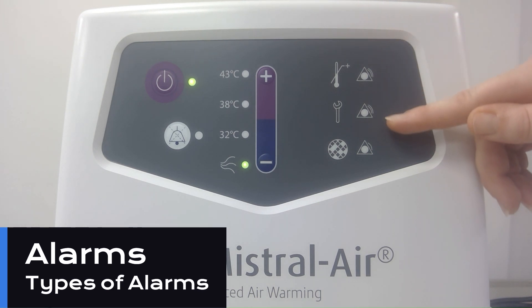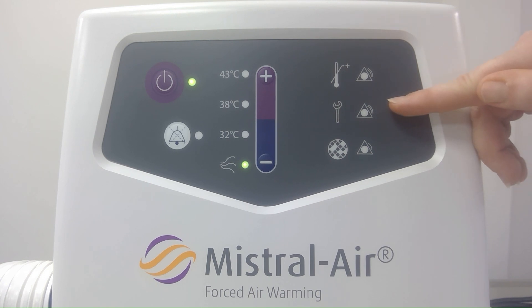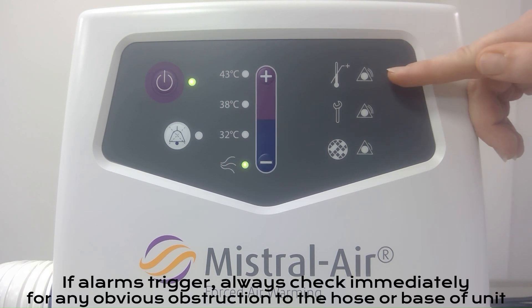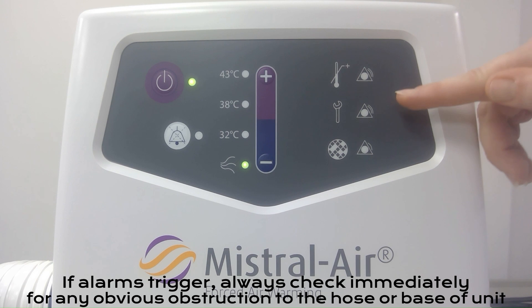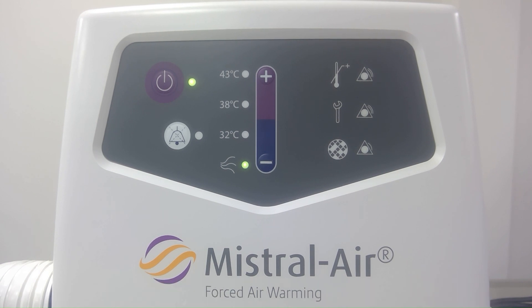Our alarm LEDs down the side will let us know any issues that occur when the unit is operational. We have an over temperature alarm and a technical or internal component failure alarm. If either of these alarms trigger, your device will enter a standby mode and it will turn off the fan and the heater, to make sure that your patient is well protected if there are issues occurring. We can refer to our user manual for a full description of what alarms may trigger, as these are described by a combination of beeps and lights at different intervals.